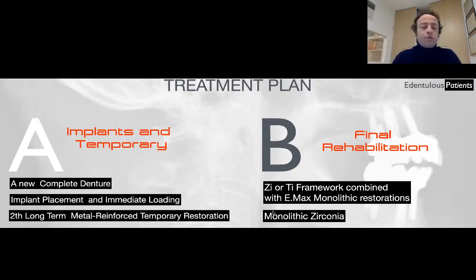And if the patient tells you, for example, okay doctor, but in the other clinic they want to offer me a metal prosthesis with acrylic like a final one, you can answer, okay, you can do it, but first ask them if they can guarantee the prosthesis for 10 years or even 5 years. If they say yes, maybe you can do the prosthesis and go there if you want. But of course, no one can do it, because everyone knows that with this kind of prosthesis, we can have this kind of problem. Okay? This is something that for me makes the difference.